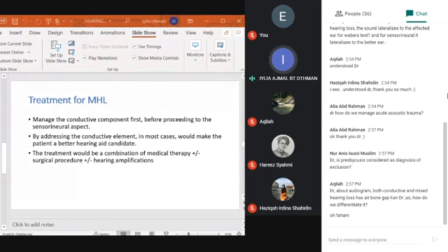Okay, because sometimes in your previous group, even the previous final professional exam, they can't differentiate the different types of audiogram. Is it conductive or sensorineural? Okay. There's only a few things that you need to know in ENT, and we like to ask you about otology somehow.